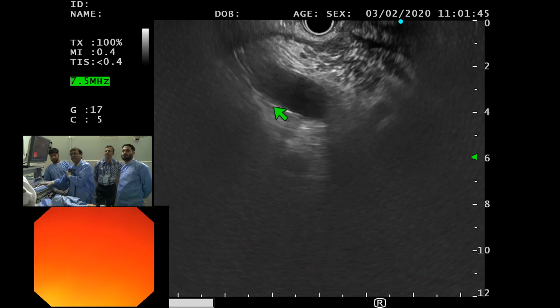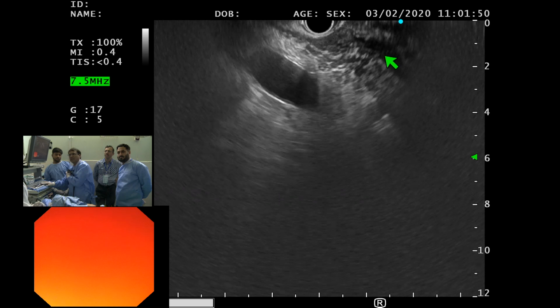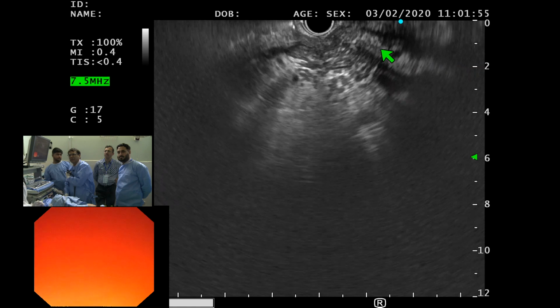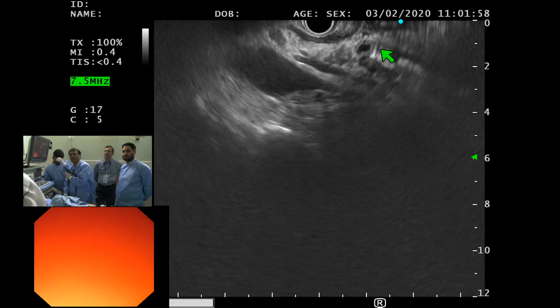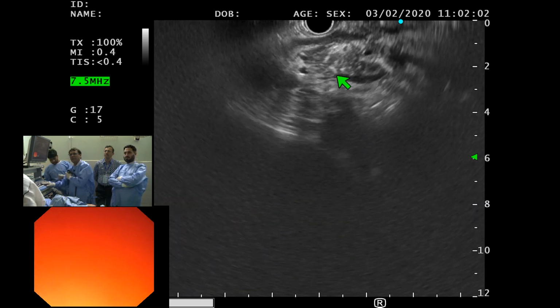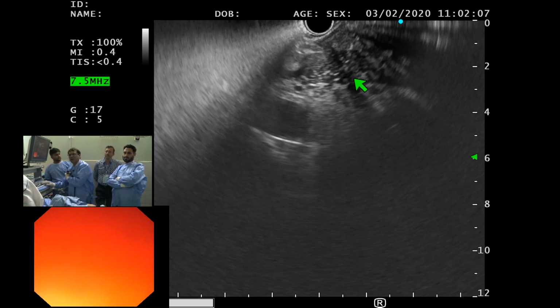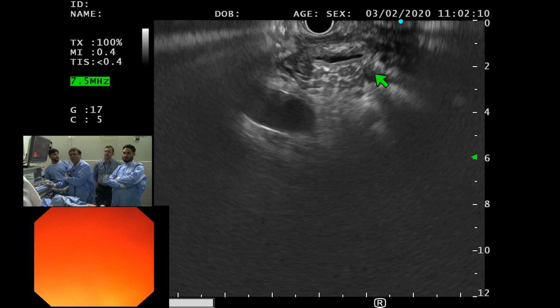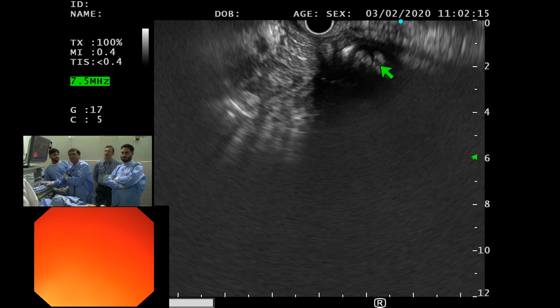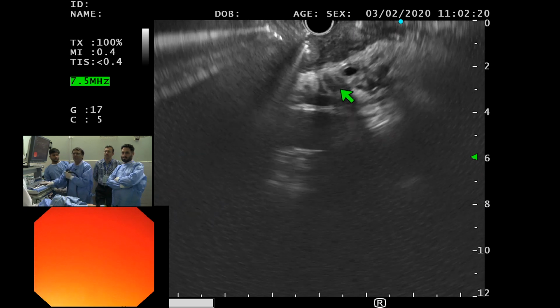Aorta right there. You can see the uncinate is here. You see the pancreatic duct and the bile duct right there. The bile duct is still quite thick right there. The whole distal bile duct wall is thick. And the PD is right here, but not very prominent. And all the inflammation, foci, strands. But the majority of that necrosis is in the pancreatic neck and body and the rest of the pancreas. You see all that? It's all necrosed.